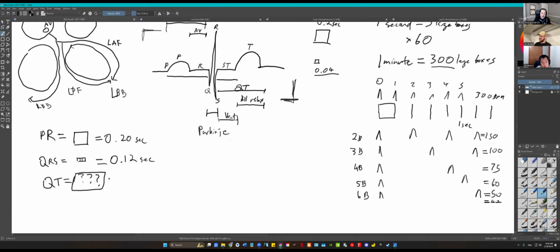Because think about it. If you're going to have a heartbeat, let's say someone's racing down the parking lot, the heartbeat's narrow in time. Where are you going to get more time? Are you going to shorten the QRS any? Are you going to shorten the P wave any? Maybe some of the PR.